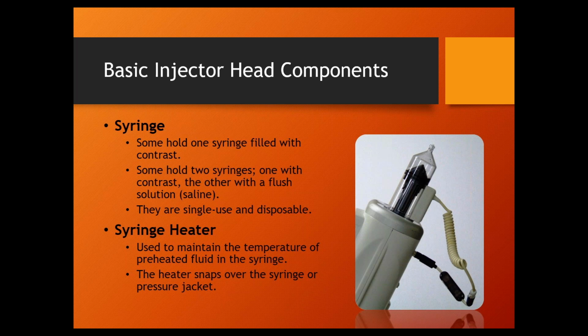The contrast fluid, it's nearly thin as water, but there is a slight syrupy texture to it. Very slight. And you know it immediately when you come in contact. You don't have to worry about it getting on your skin or your clothes. It's literally like maple syrup. Getting maple syrup on your skin, it doesn't do anything, just washes off with water. But as soon as you come in contact with it, it's tacky. Even when it's dry, it's like barely dried paint. It's a little tackiness to it.